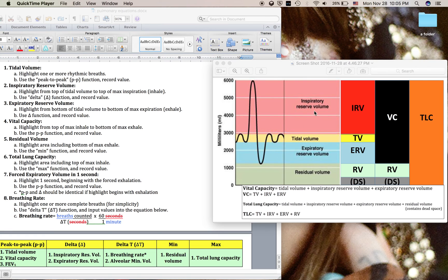The volume that your lungs have reserved for inspiration or inhaling is referred to as the IRV. We can measure this using the delta tool, going from the top of a typical inhale to the top of our maximum inhale. The amount of air let out during a max exhale differs from our normal exhale during tidal breathing, and we call this difference the ERV, or expiratory reserve volume — the volume your lungs have reserved to expire or exhale.